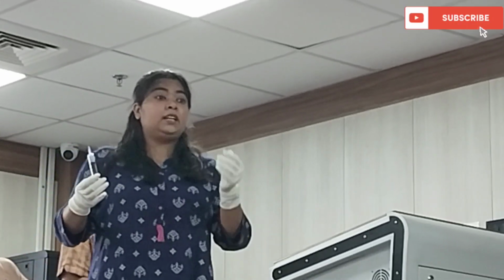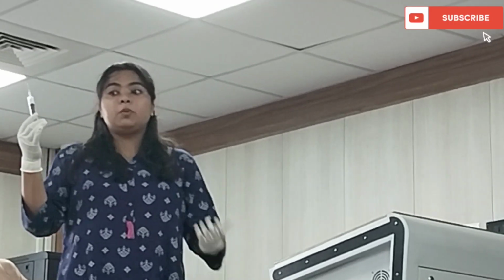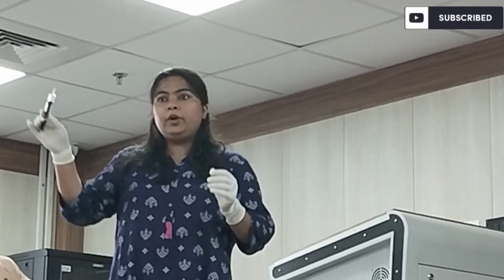After that, when your blood collection is done accordingly in the appropriate vials, you will have to discard the needle. Before, you used to get needle burners and things like that, but nowadays biomedical waste management has become very active in all the government hospitals. So you know the sharp objects. For the sharp objects, where do you dispose? In the white box with the solutions given over there. We dispose the needles accordingly.